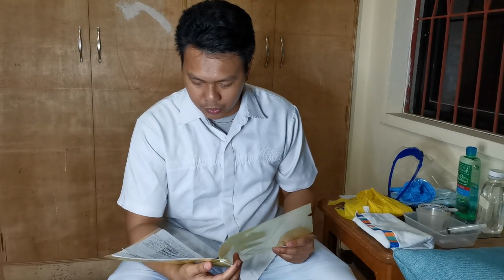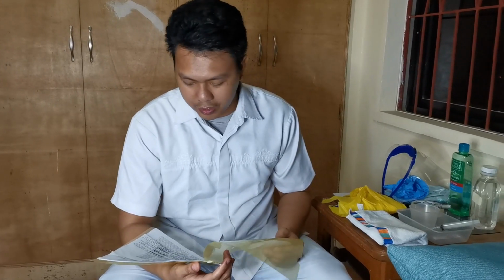Number 2. Review orders for irrigation and types of irrigation solutions used. This is done to confirm the doctor's order for irrigation and what specific type of solutions to be used for the patient. So we have here a doctor's order to do wound care using normal saline solution.